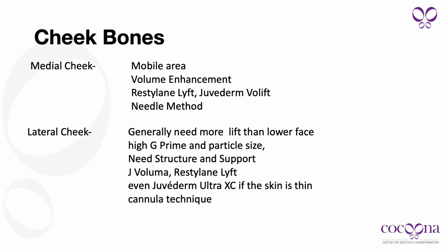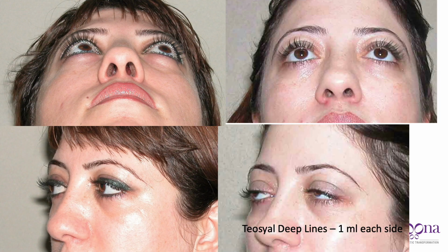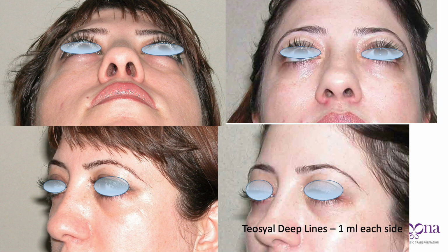So products like Juvederm Voluma, Restylane Lyft, or even Ultra XC can be used with cannula technique. So in this patient, I've used 1 ml on each side, placing 0.5 ml over the zygomatic arch and 0.5 ml distributed in the middle or the medial cheek.